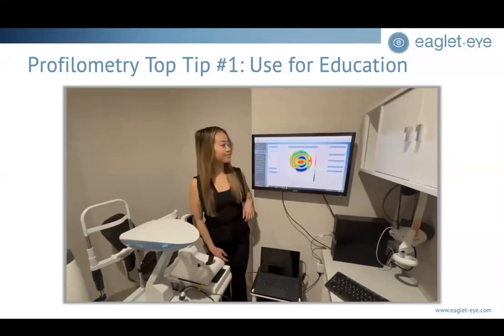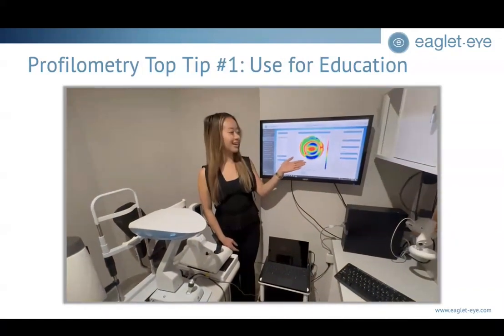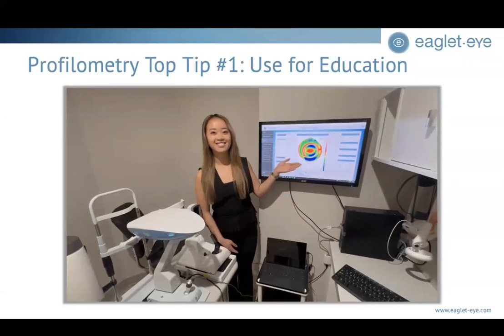So this is my top tip number 1. I love using the device for education. We can use the tool as a teaching tool. We love showing patients when they come into the clinic. Everybody has a story, their own unique history of difficulties they've had with their vision, or surgeries they've had, or failures with contact lenses, or why they just couldn't be fit with something else.